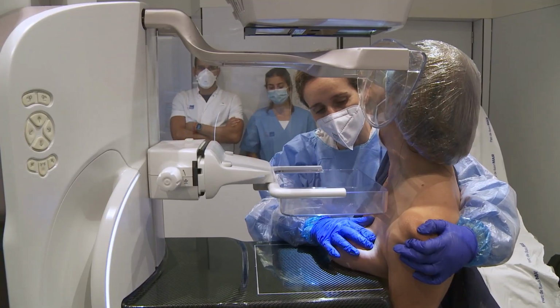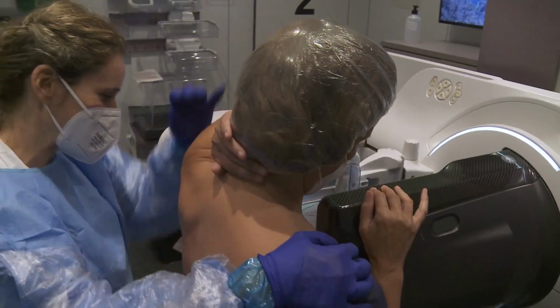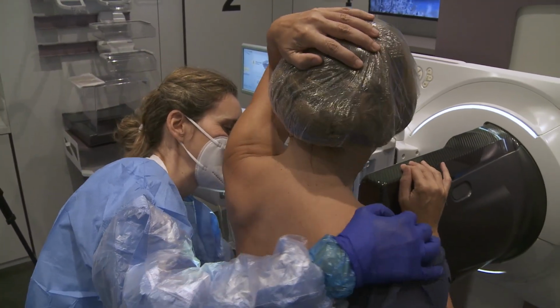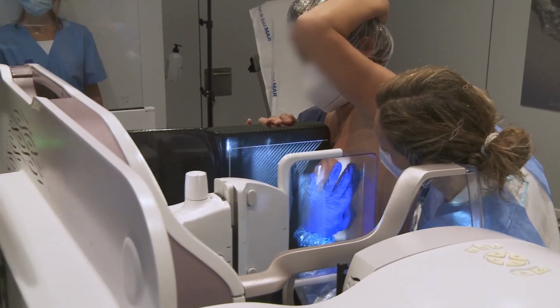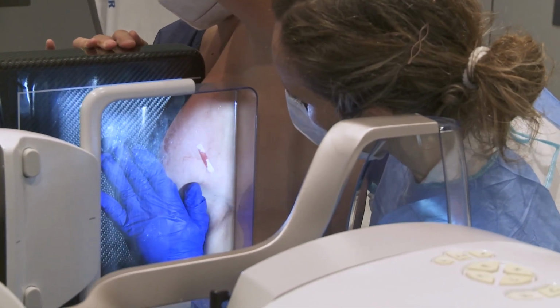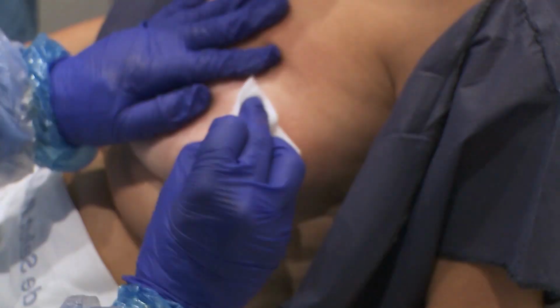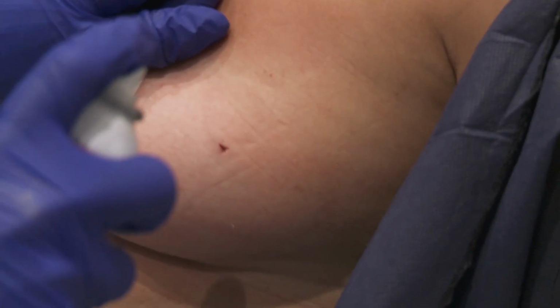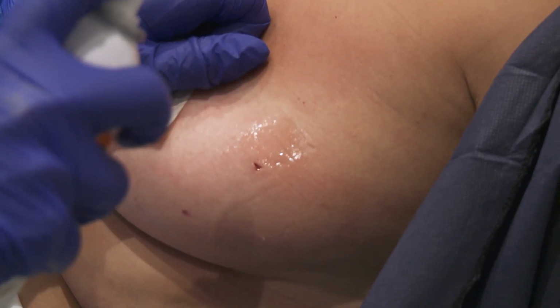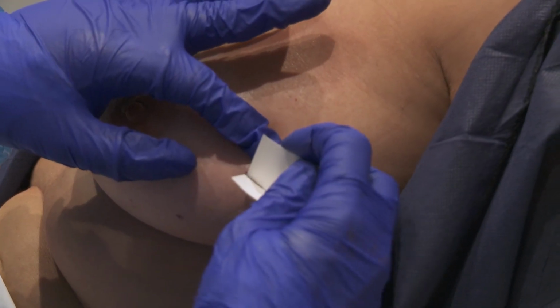Routine CC and ML views are carried out to check the tissue marker placement. The entry point is covered with closure strips and a gauze.